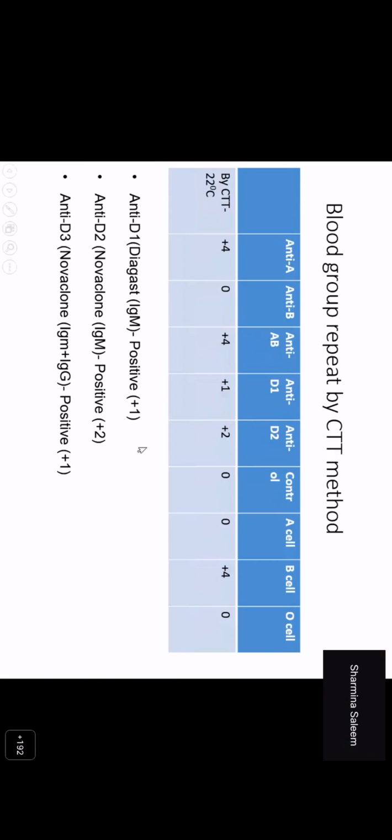He also asks how to report such weak antigen in routine practice, because on slide method it is looking negative, but on microscopy it is positive. So that has to come with a comment. If you are getting such an observation, you definitely give a comment that further confirmation with confirmatory test in a blood center is recommended. And in the meantime, as a donor, this individual can be considered as RH positive. However, as a recipient, he may be considered as RH negative till complete resolution of the D status is done with a genotyping or a molecular test.